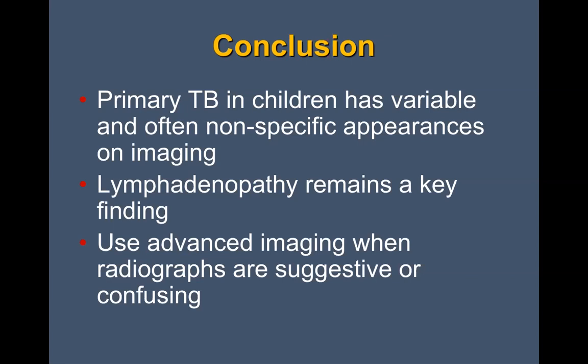But I think that the findings are so subtle, even on older children, that you're going to be better off just getting 2 views. The radiation dose from a 2-view chest X-ray is hardly more than a 1-view. And most of the time, a good technologist is going to be able to get you a good X-ray. And so I would recommend 2 views at every age.